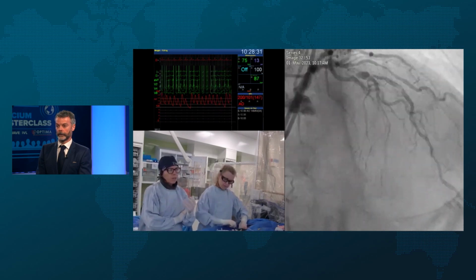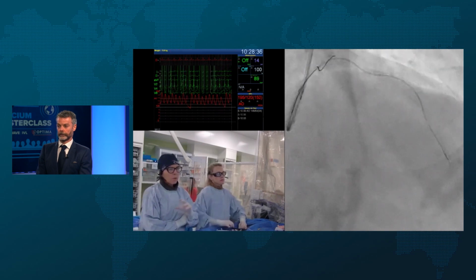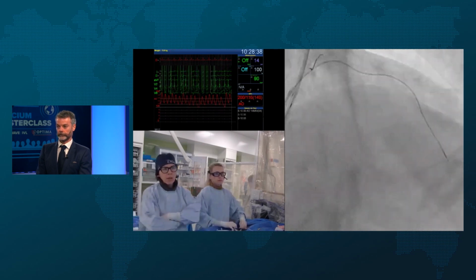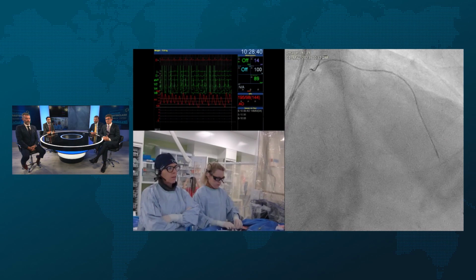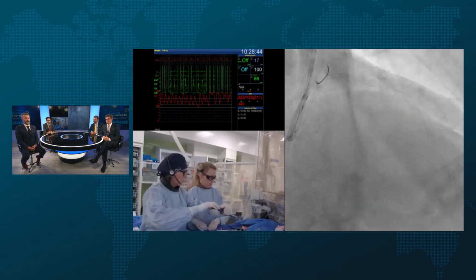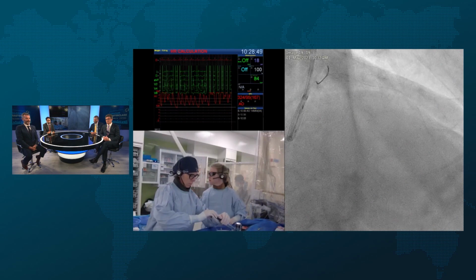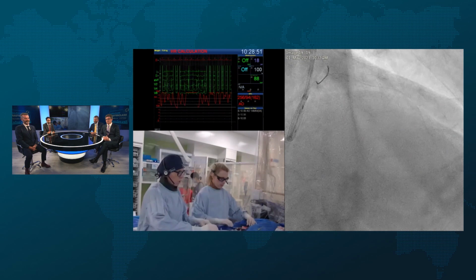So, and the circ looks good. We've got a wire in that, so we've got access to it. So we're less worried about the ischemic impact of what we're going to do in the LAD. Yeah, and I think we can see why the collaterals to the right from the LAD aren't so good. The LAD's not in a happy place, is it? No. It's a bit ischemic.